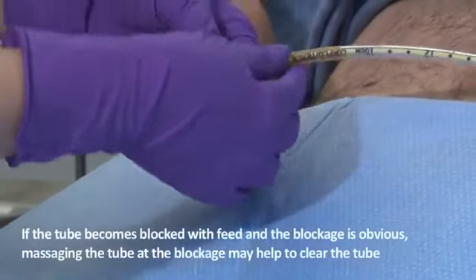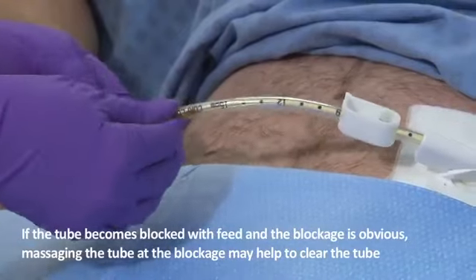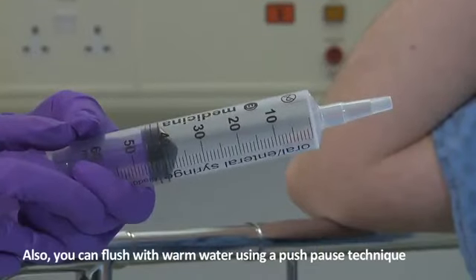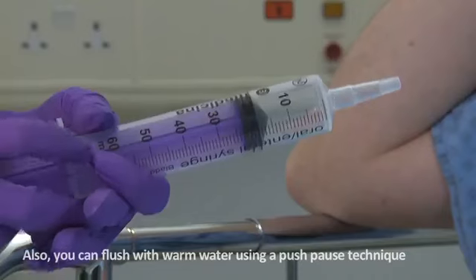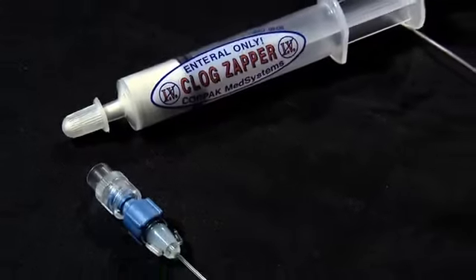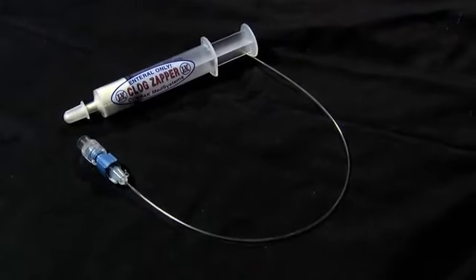If the tube becomes blocked with feed and the blockage is obvious, massaging the tube at the blockage may help to clear it. Also, you can flush with warm water. So if you flush with a push-pause technique, you create turbulent flow. If these don't clear the tube, soda water may help. Alternatively, use the clog zapper, which is designed specifically for unblocking feed from any feeding tube.